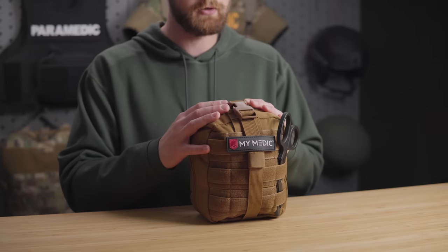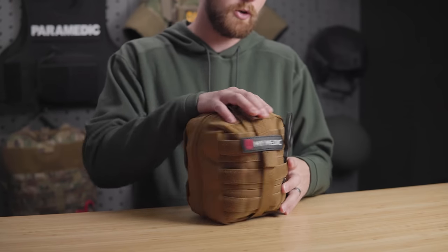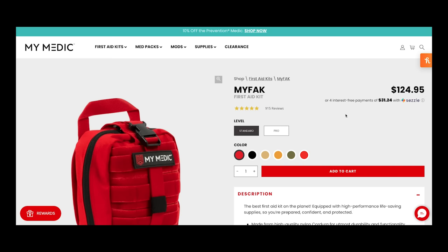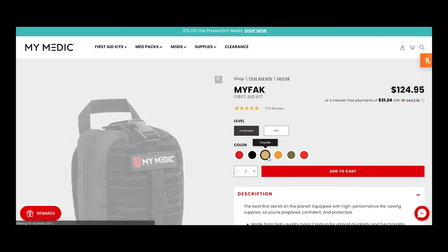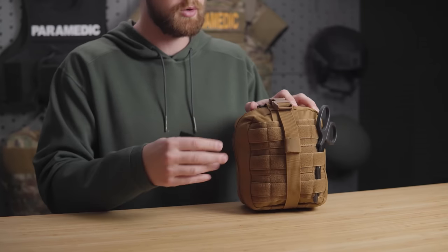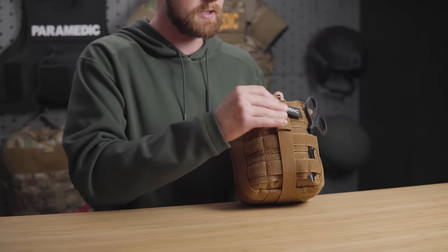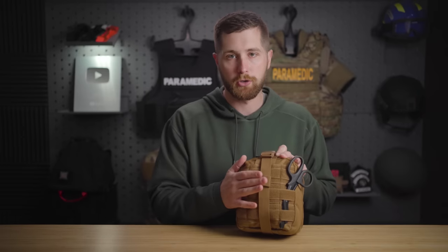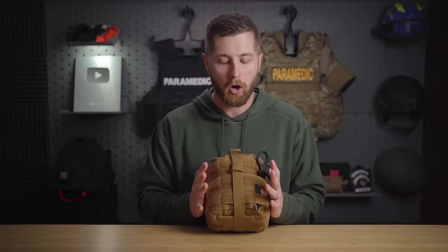This right here is their most popular kit — the MyFAC, their basic first aid kit. They've got their MyFAC large, which I've reviewed, which is absolutely monstrous, and their everyday carry ones. On the outside, it's a pretty standard case. You have a full Velcro front, which is nice if you want to put morale patches or identification. It comes with their MyMedic patch, and the back is all a MOLLE field so you can attach an exterior tourniquet. I would always recommend carrying your massive bleeding supplies on the outside if you can, so you don't have to dig through it — especially because this kit is not just your basic stop-the-bleed supplies.